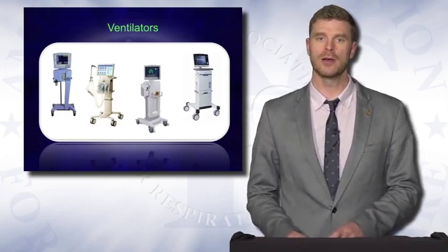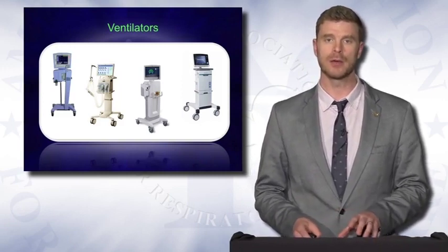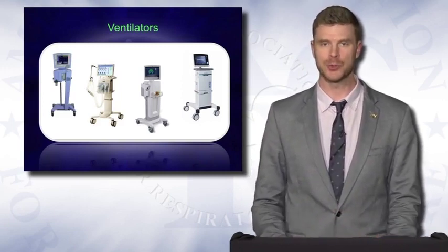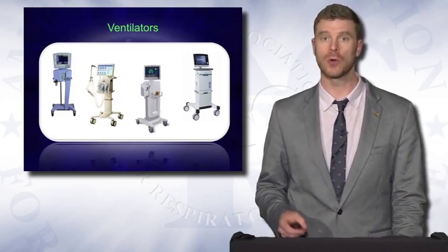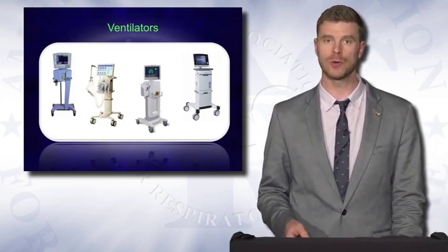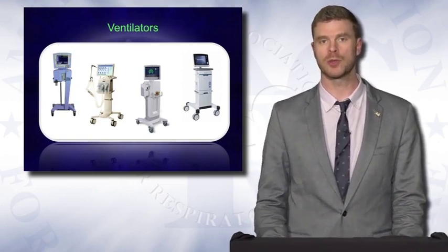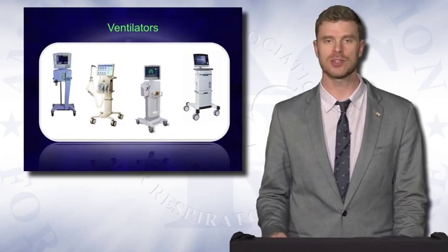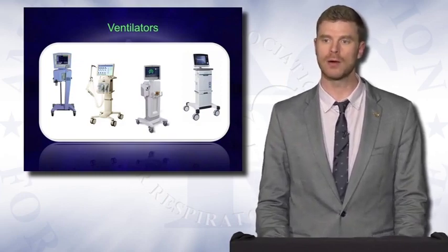The other really wonderful thing that's happened probably in the last decade or so is we've seen a lot of these technologies being integrated into mechanical ventilators, meaning that we don't have to independently own and operate devices that monitor CO2. The advantages of CO2 monitoring will be, number one, displayed on the ventilator monitor, and in some cases, the calculation of VCO2, that is CO2 elimination, will be automatic as well.